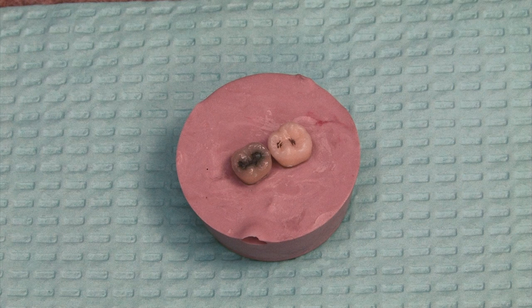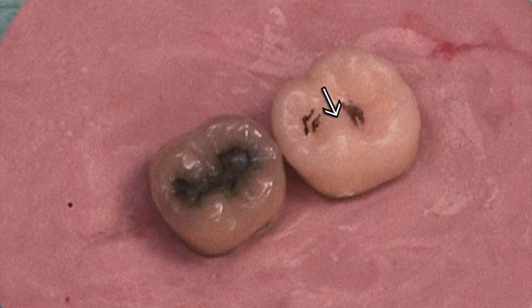Here we have two molars that are going to be worked on in the form of placing direct restorations. You can see in the one that does not have the amalgam, I have an arrow pointing to the area between the two areas of marked decay. That is a transverse ridge. If the decay remains isolated to those two areas, we will not cross the transverse ridge, keeping the strength of that tooth intact. There is no need to connect it unless the decay is actually running between those two cavities.